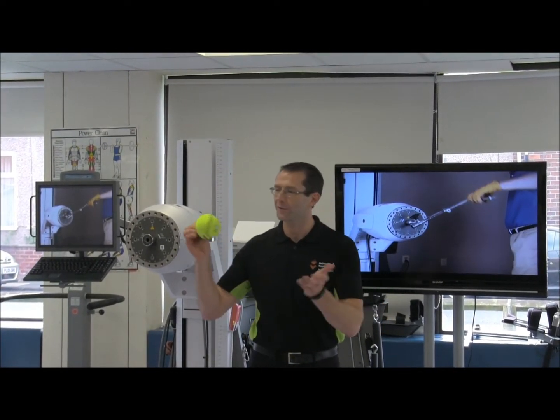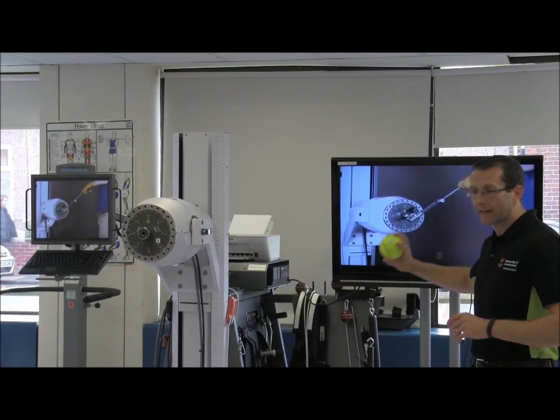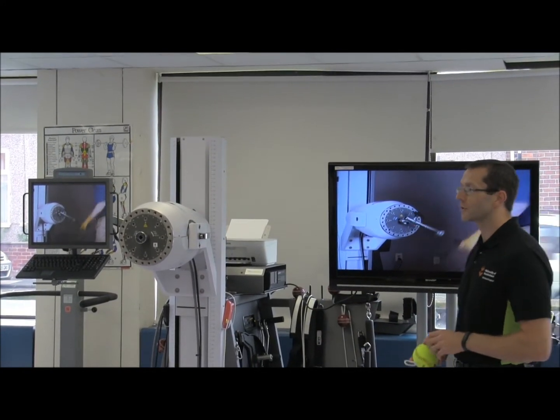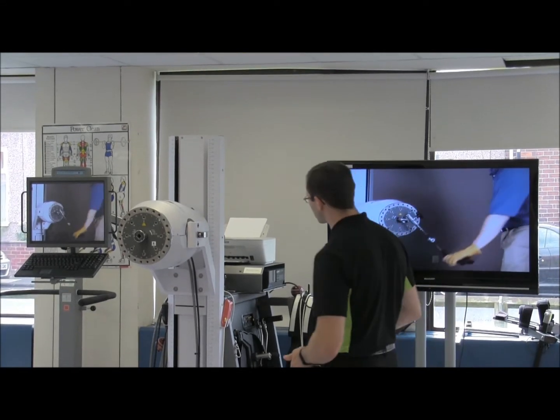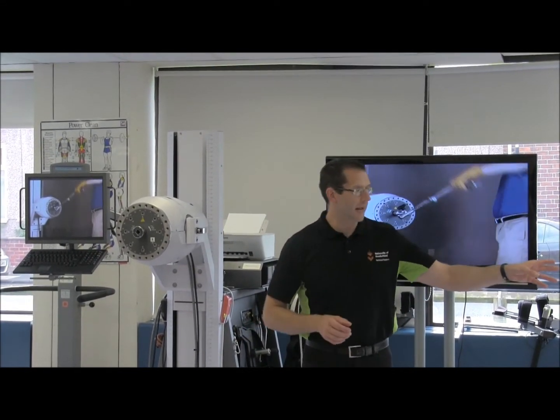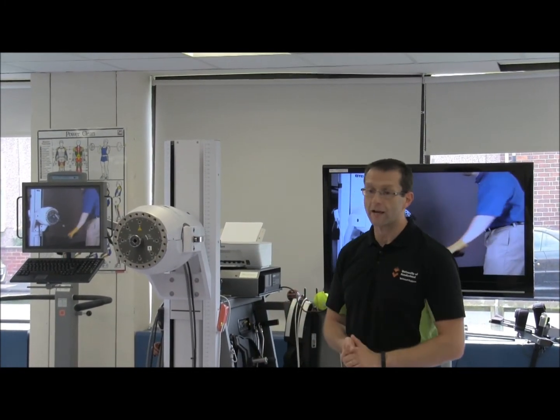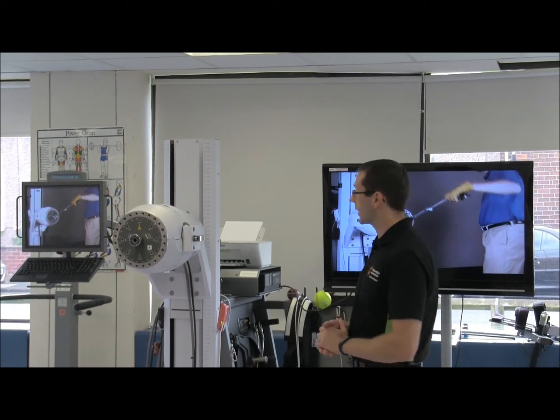You can tell it's an American product because we've got the softballs on there. But these things can attach to the cable, and then you can look at throwing motions and even catching motions as well, because the system works very similar to the dynamometers in that we can work concentrically but we can also work eccentrically. So we're going to demonstrate that.